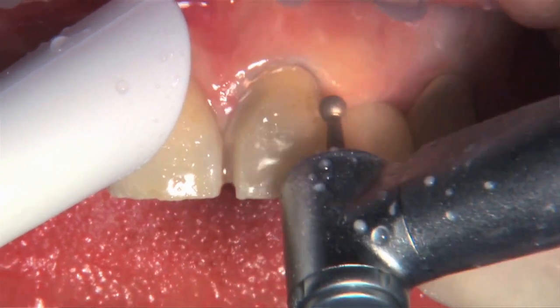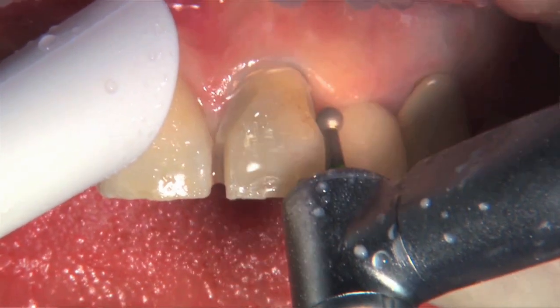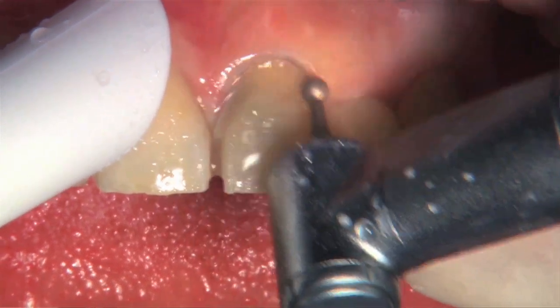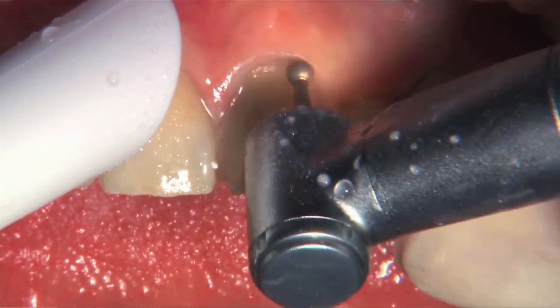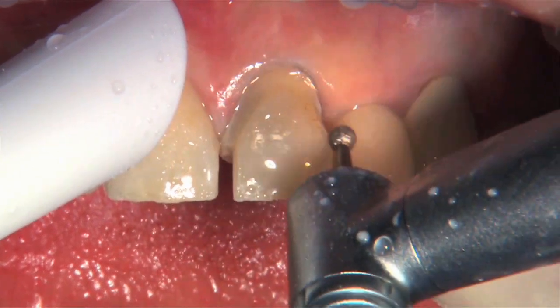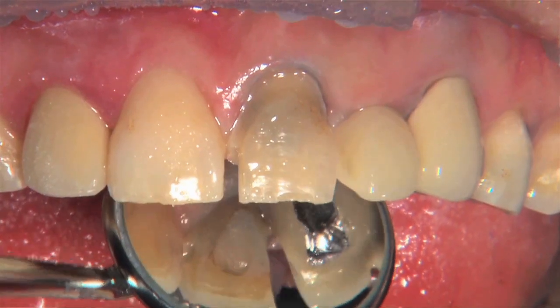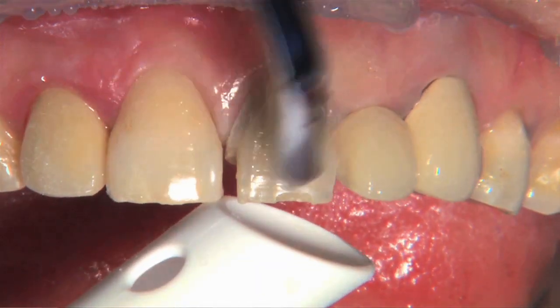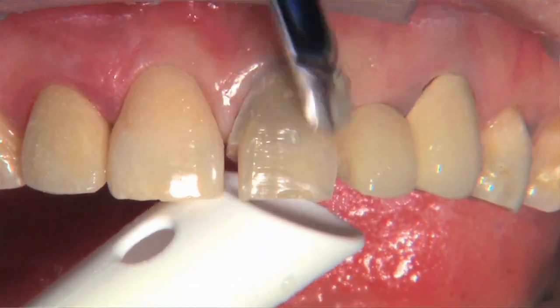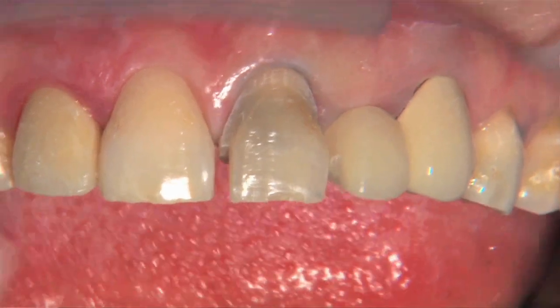And that half circle that I'm prepping into the tooth is going to do two things. It's going to make sure that we have enough reduction in that area in the gingival third to have an aesthetic restoration. And at the same time, it's going to be the beginning of our margin formation, almost the end of it. Because that half circle, when we do the rest of our axial reduction, will turn into a quarter circle. And that quarter circle is the perfect deep chamfer. This is the easiest margin you will ever prep on a crown, and the nicest margin you'll probably ever prep on a crown if your hands are anything like mine.